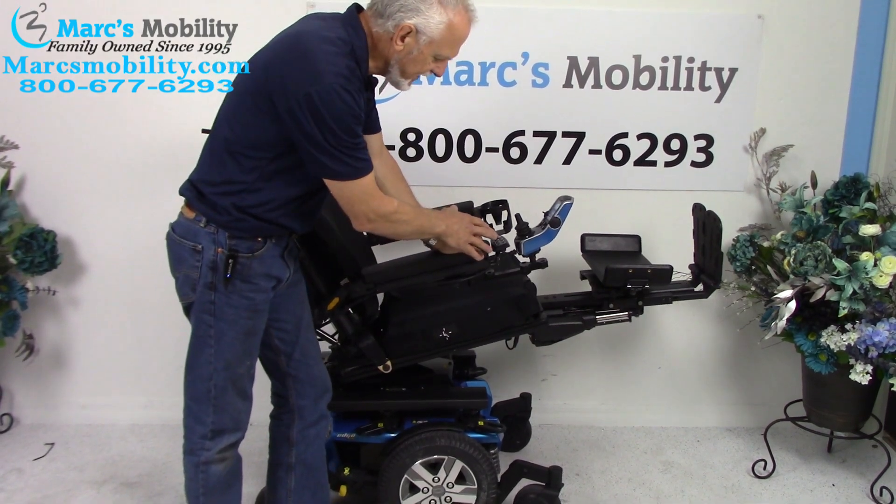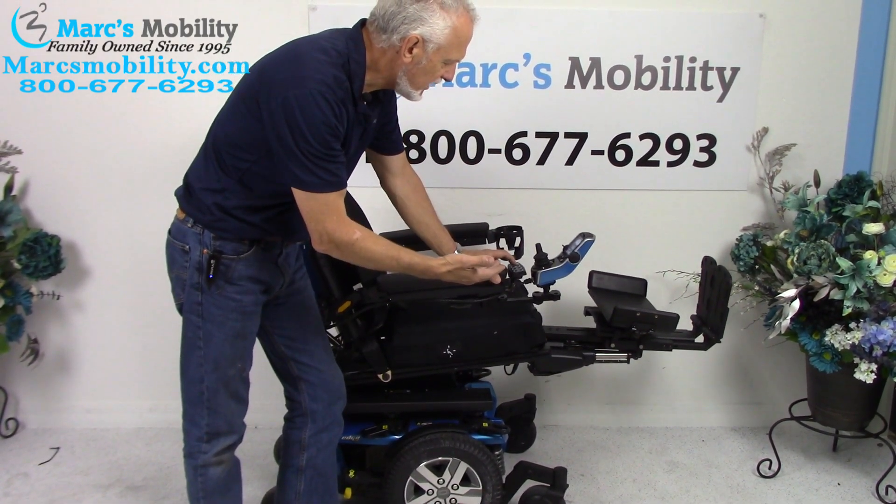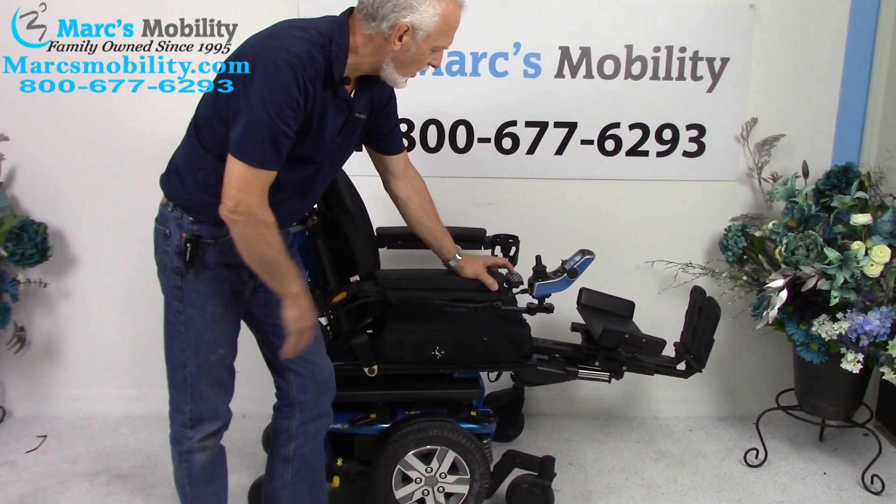These buttons — you have to touch them twice. Once you let go and go back, it goes the opposite direction, so you have to hit them twice.